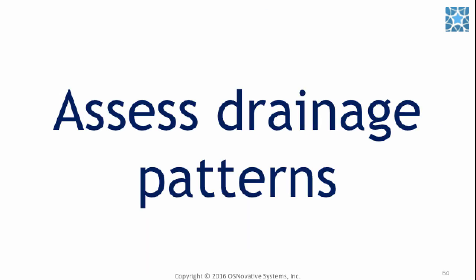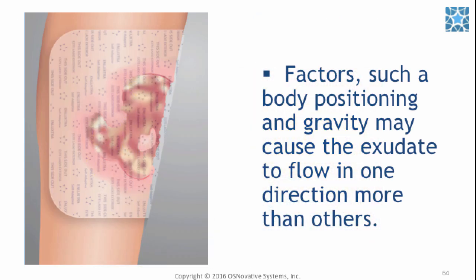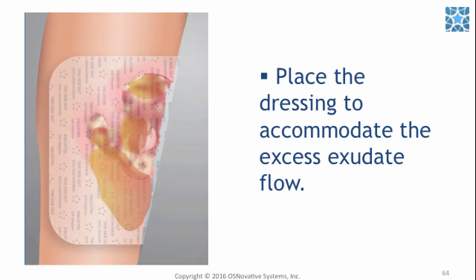To optimize Enluxtra placement for best results and longer wear, study the drainage patterns upon removal. Factors such as body positioning and gravity may cause the exudate to flow in one direction more than others. Place the dressing to accommodate for excess exudate flow.